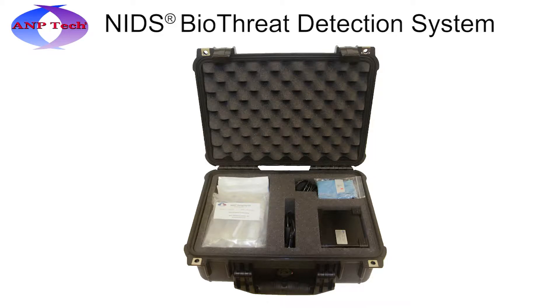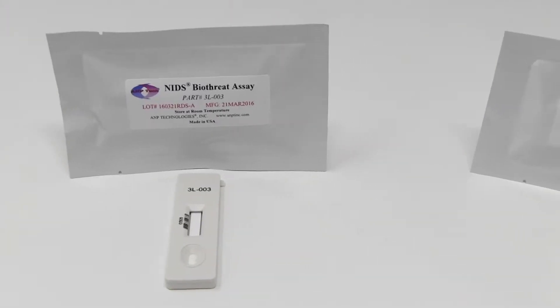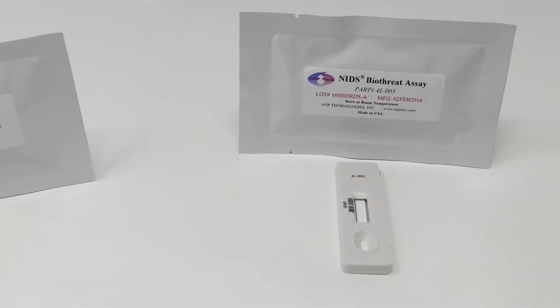A&P Technologies presents the Nano Intelligent Detection System, consisting of multiplex biothreat assays and a handheld standalone reader. The commercial system comes with the commercial assays 3L-003 and 4L-005.